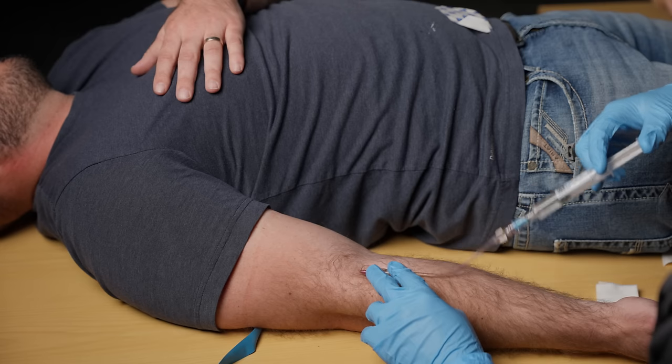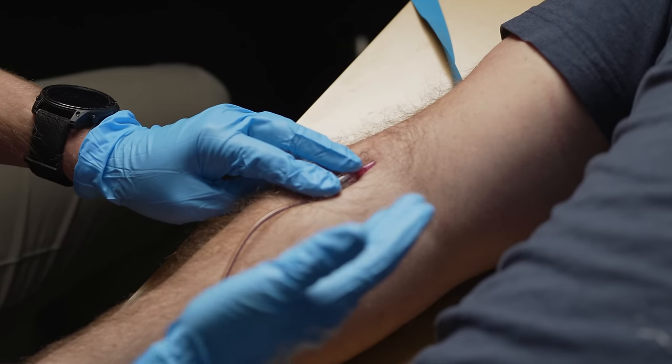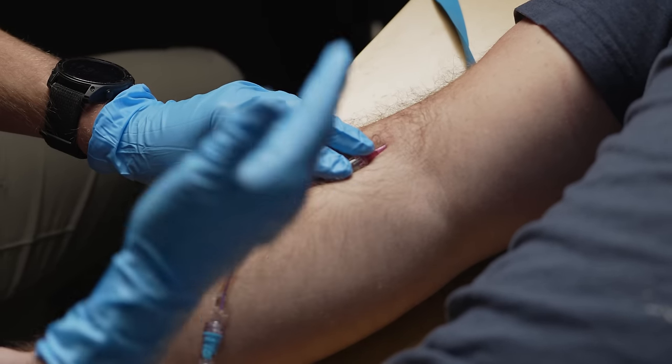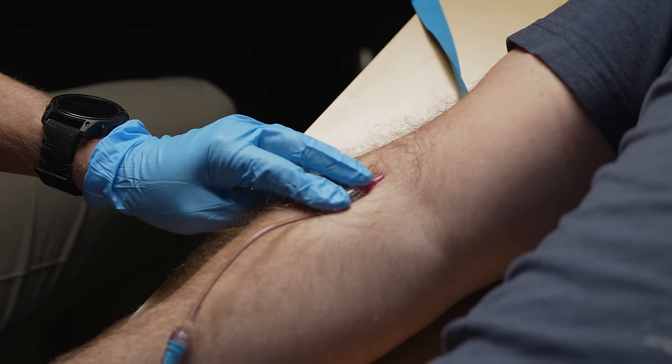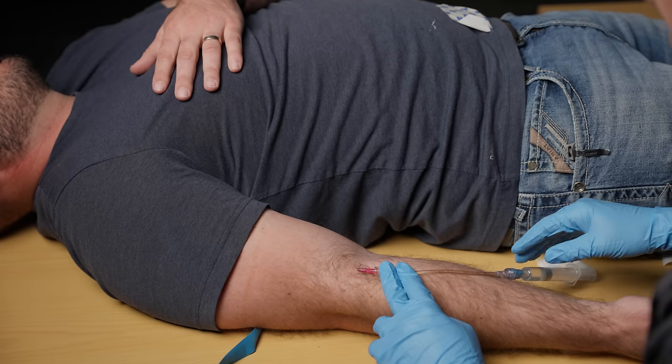If this wasn't a good IV I'd see some bubbling in the skin — that's called infiltration. The other thing the patient might experience is severe pain; it might hurt a little bit more. This isn't a painless procedure but as you're injecting meds it shouldn't hurt very much, and oftentimes patients can even tell you they taste the saline if it's a good IV.